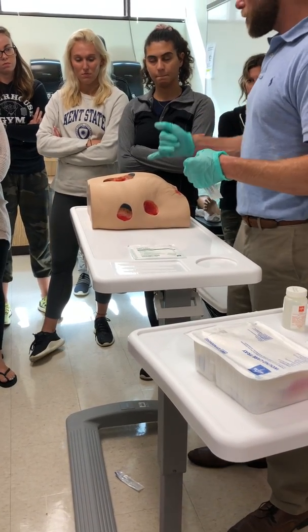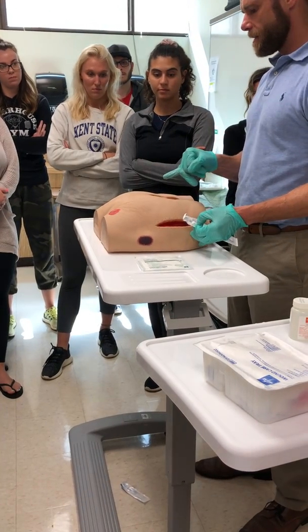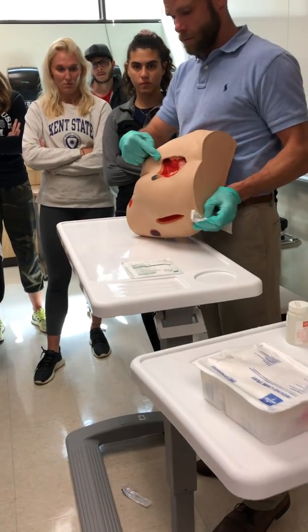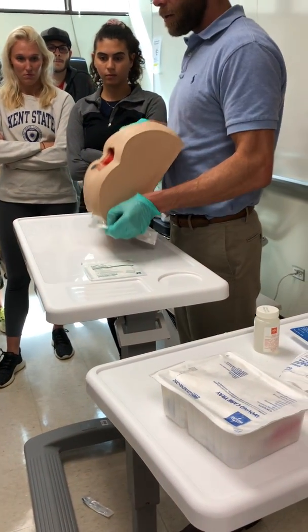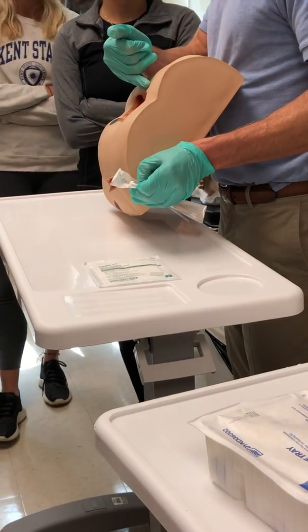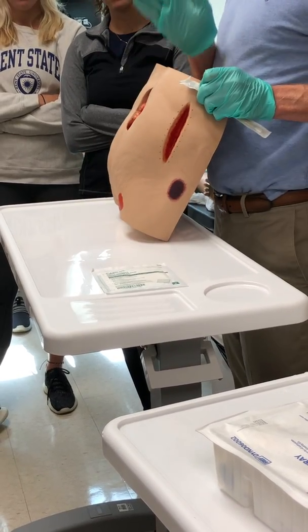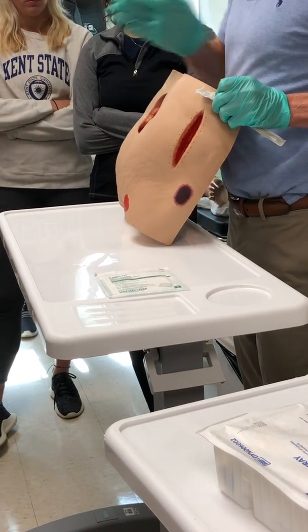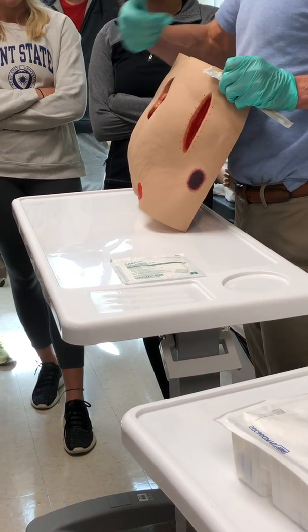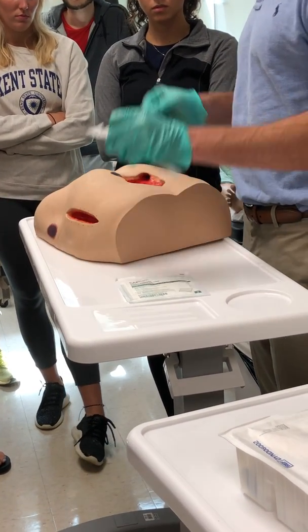Next, you notice that on this patient, man, he's so easy to turn around, at 7 o'clock he has a tunnel. For those of you with the camera, that's the tunnel. So I have to measure the depth of the tunnel. And then from... I can't see my clock up there. From, let's say, 10 to 2, right? Because the head's always 12, and the feet are always 6. So from 10 to 2, I have undermining. This is undermining. It's like a cave where miners go. That's a tunnel. This is undermining. You guys see the difference? I've got to measure both of those.